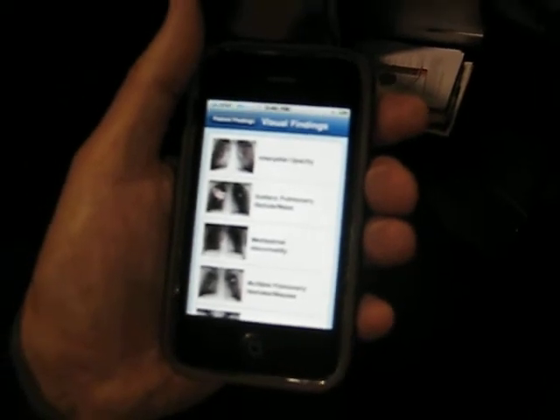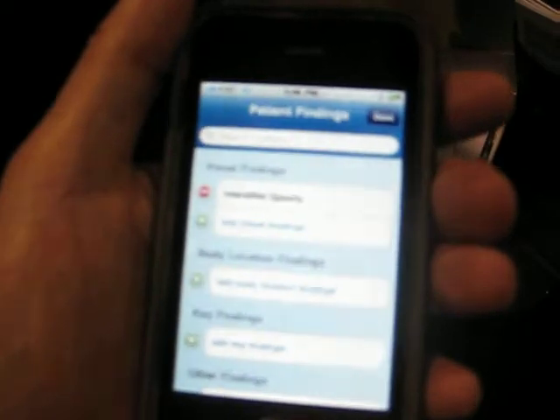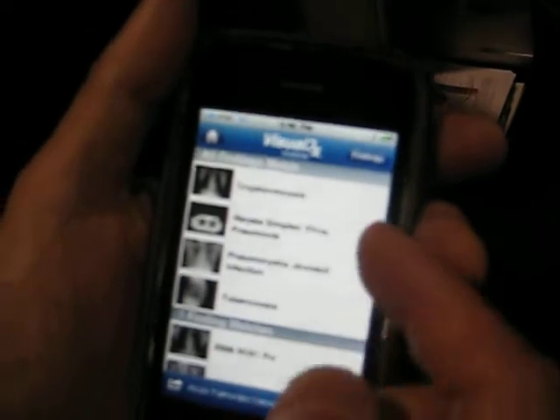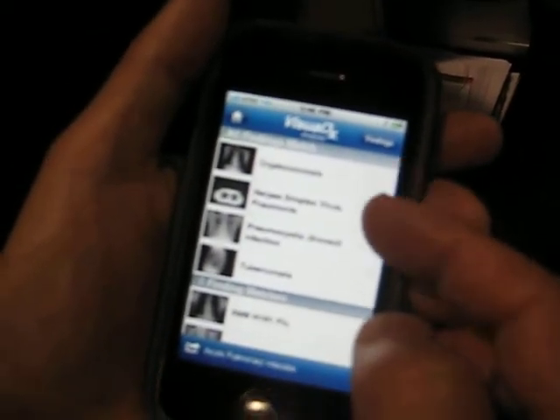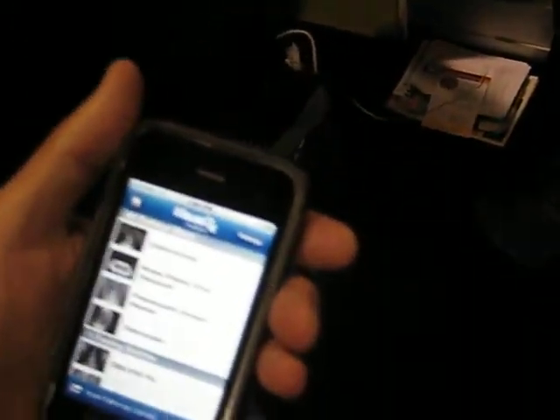If you have a product that shows you the findings of a disease, it only helps you if you know the diagnosis. If the patient has an interstitial opacity and your patient also has HIV — you took a history, they have HIV — I go ahead, I type in HIV, select HIV, and say done. It's going to show me what the differential is of an interstitial pattern in an HIV patient: cryptococcosis, herpes pneumonia, pneumocystis pneumonia, and TB — diagnoses you probably wouldn't have been able to think of otherwise.